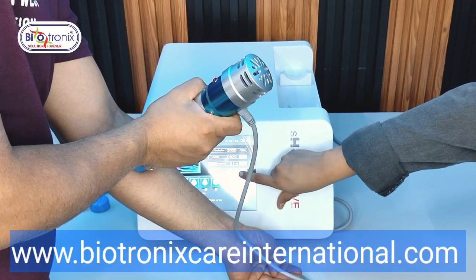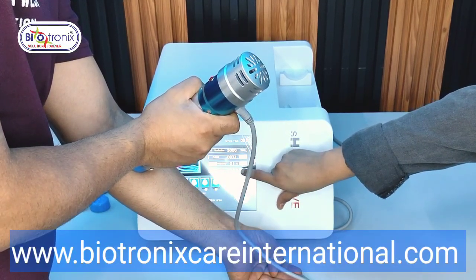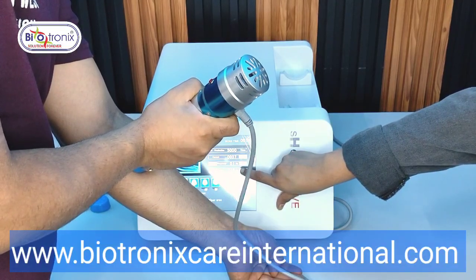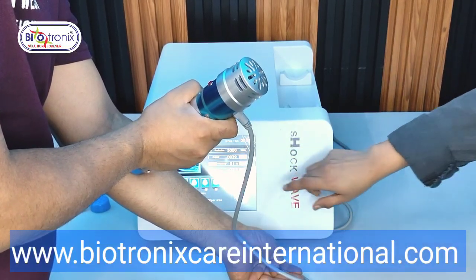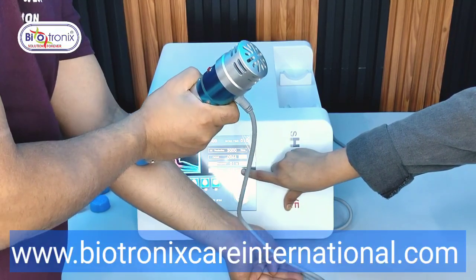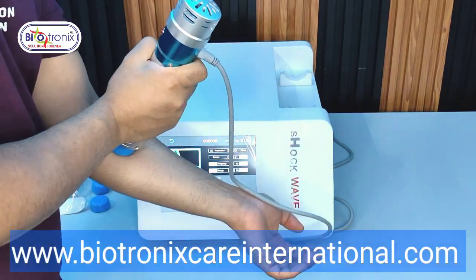15, 25, 35, 45, 45, 55, 65. 65 is quite enough for me for that joint.